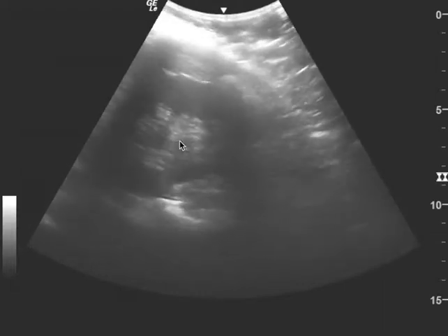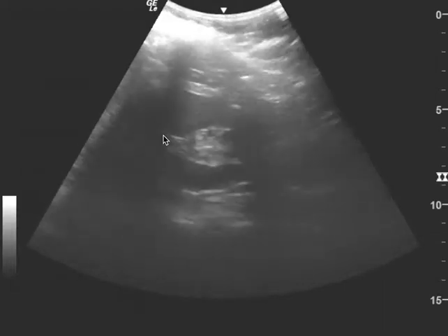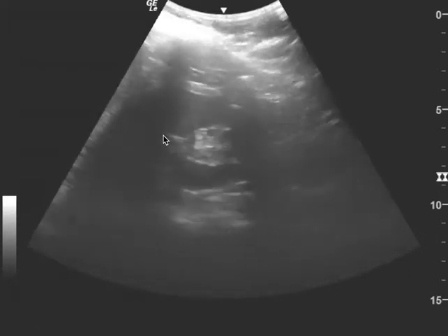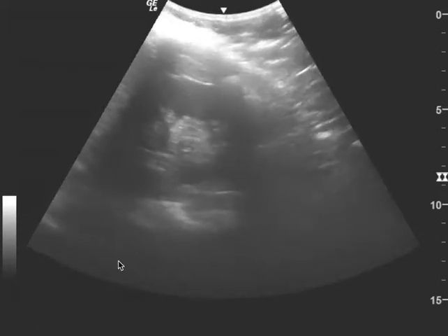This is a FAST exam — this is the left upper quadrant. You have a really nice view of the kidney. When you're doing a FAST exam on the left, you want to move the probe a little bit more towards the axilla.